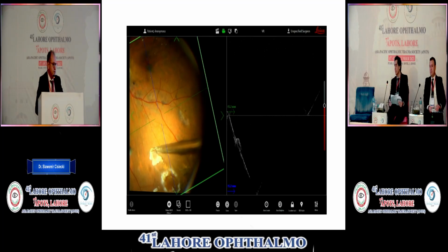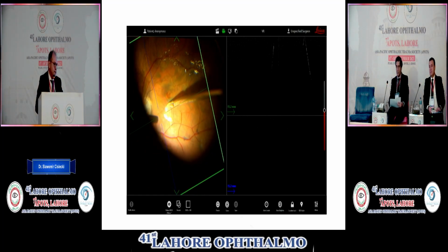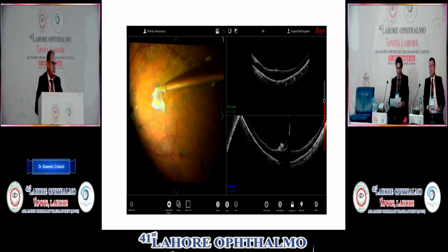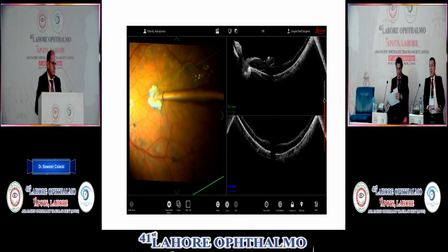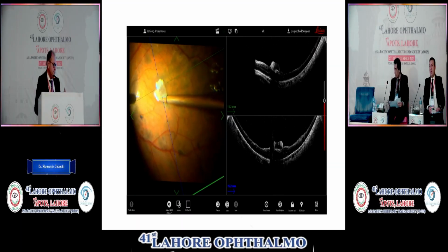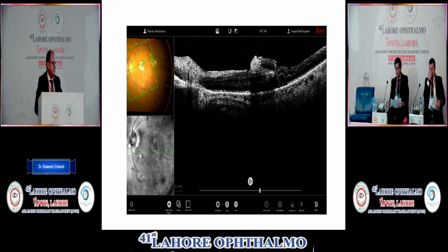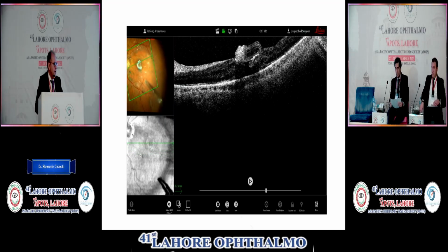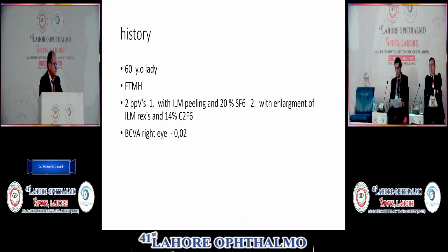The surgery is quite easy. You can do it in many ways, but usually we can cut the patch from the periphery. Addressing your question, for me it's safer to cut the graft as far in the periphery as possible from the above size, just to avoid PVR after that.